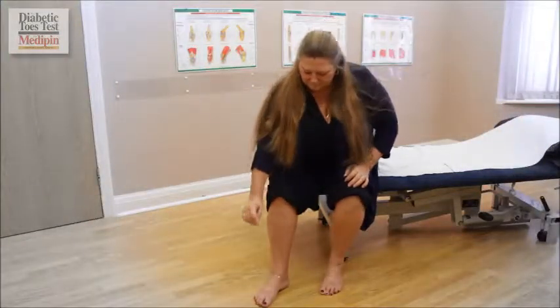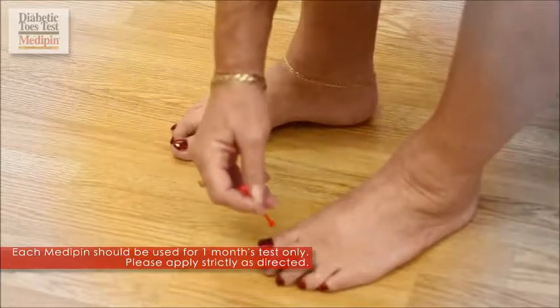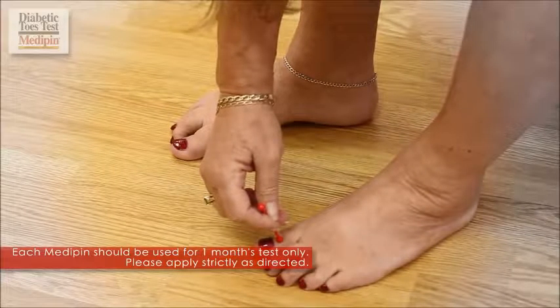Do not try to pierce the skin. You should be able to feel a sharp pinprick sensation. Then use the same Medipin to test the other big toe in exactly the same way.